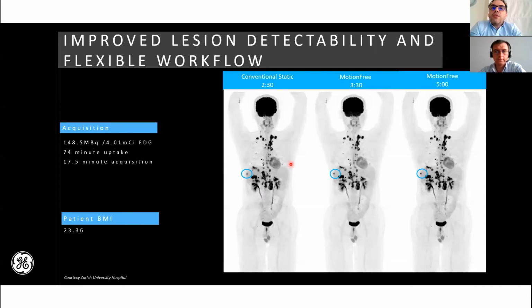So this is it for me, and now I'm giving the stage to our PET clinical leader, Mr. Siennisci, to present clinical cases. Thank you very much, Andreas, for this great presentation. That was a really comprehensive technical approach to motion free, our latest motion correction technique, which we are able to apply in PET-CT scanners from GE.